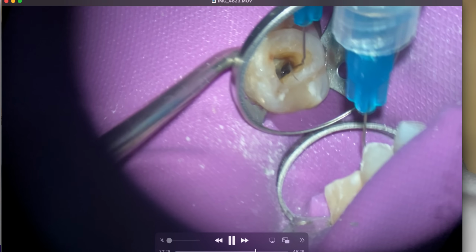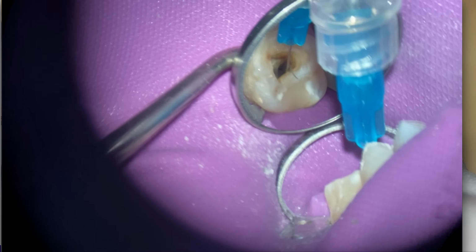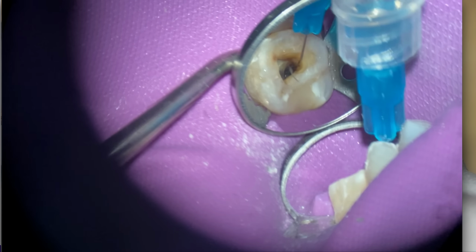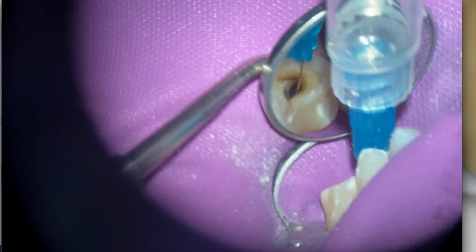There was calcium hydroxide sitting there, and I wondered if that's calcium hydroxide that's remaining, or calcium hydroxide that's just sitting on top of the lesion. I'm not sure. What I'm doing there is I'm not irrigating. I'm just using the needle end to move it around and see if I can get any motion with that.